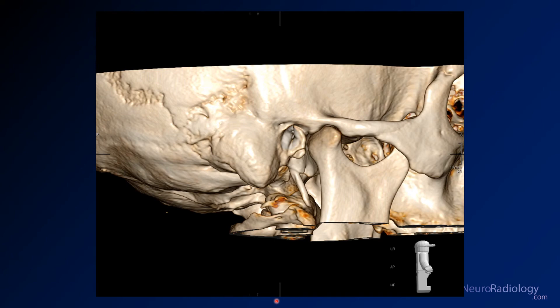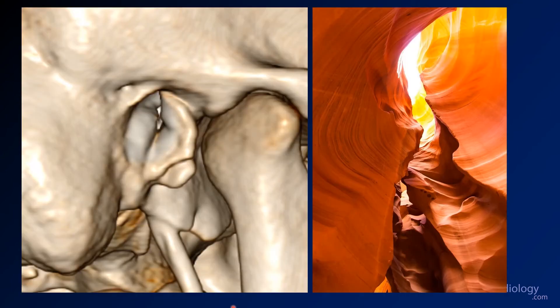Here you see some 3D projections of the same study, showing what it might look like from the outside. There's also a comparison to a photo from Antelope Canyon in Arizona — you can see it looks very similar, with rocky crags and a very narrow path.